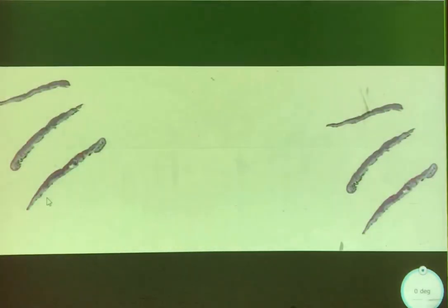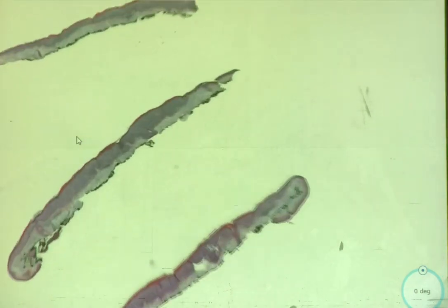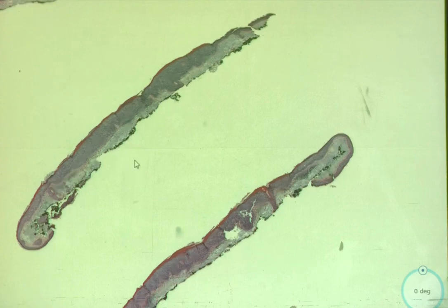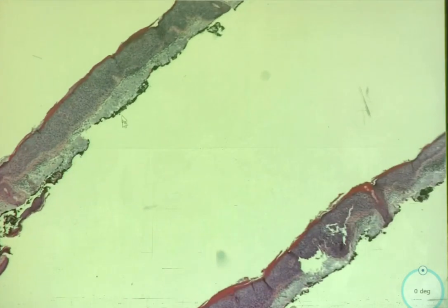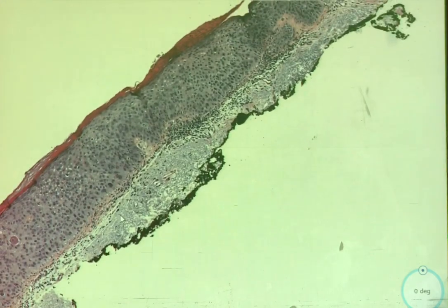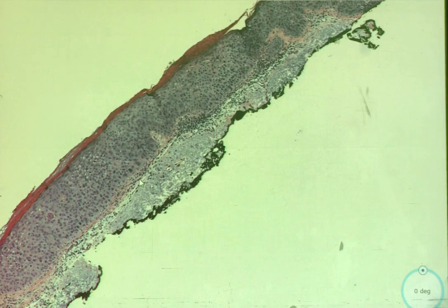So here's your slide. Again, pick whichever side you like. You're a middle piece guy, alright. So at this power, don't zoom in anymore. What do you notice? I will always push you guys to look at low power, always.